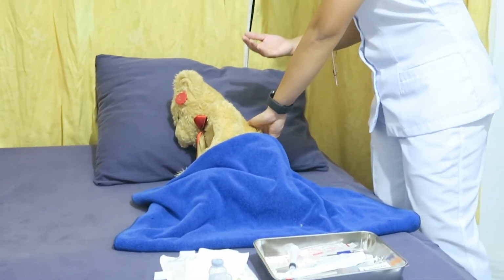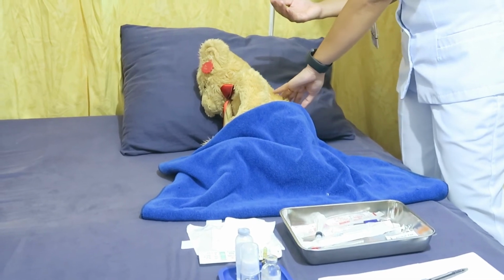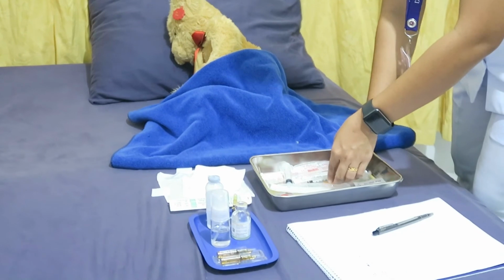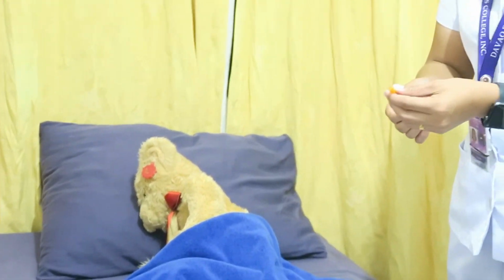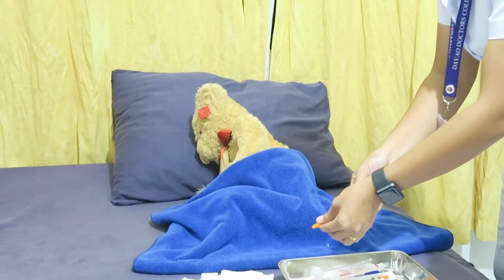And the next is to prepare the syringe for injection. So, also remove the needle cover. So, this is our syringe. Then after that, remove the needle cover and discard without contaminating the needle. So, let's remove the top.